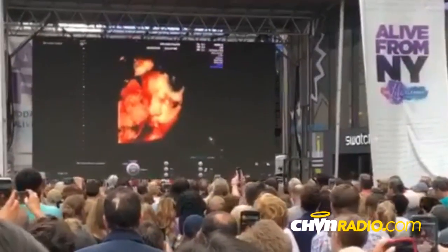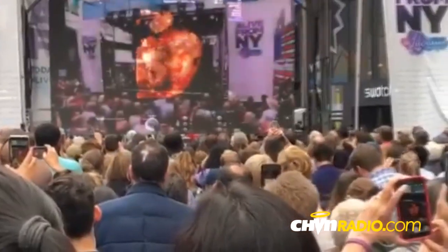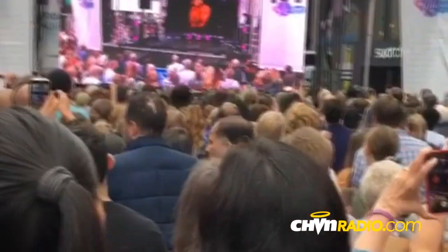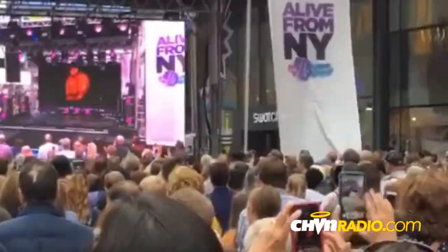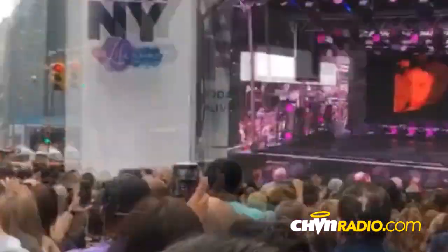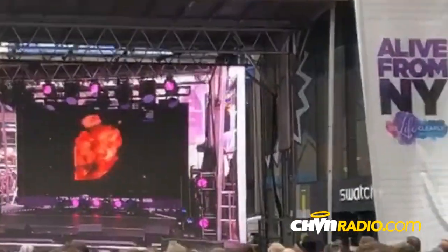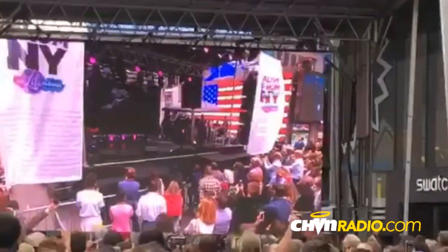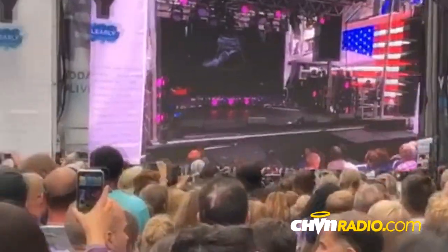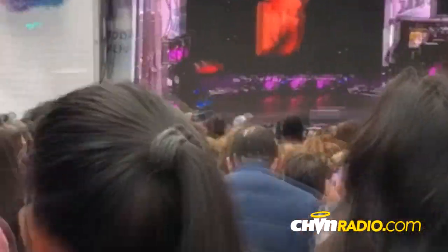See that cute little bottom lip sticking out right there. Come on, baby. Time to wake up. See if we can get a better view.